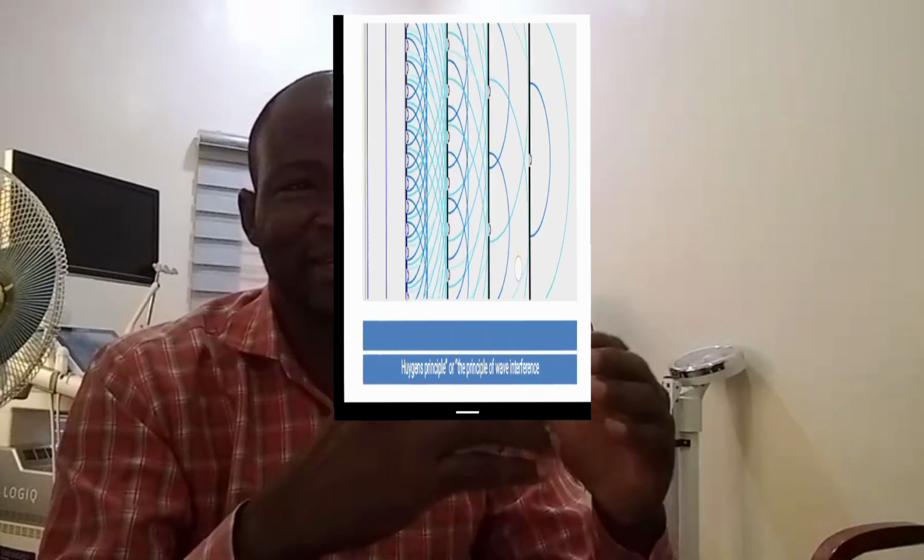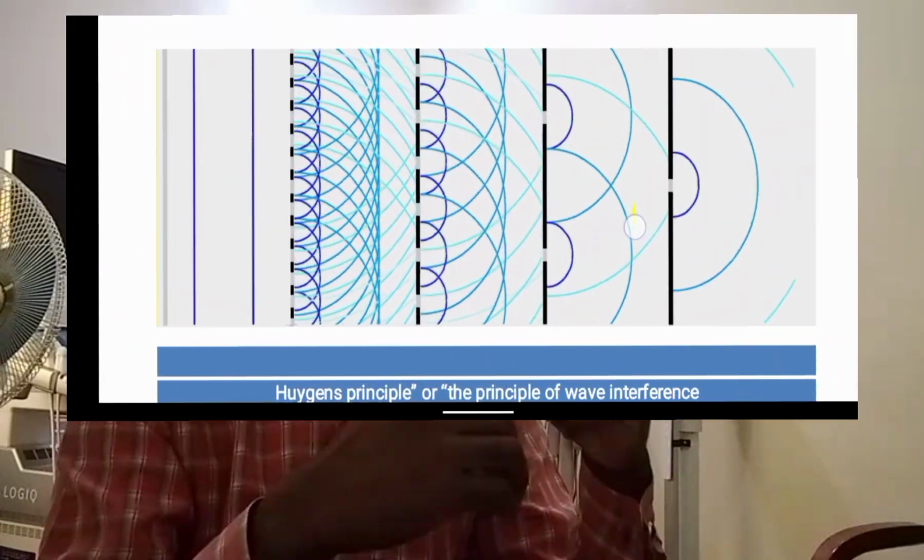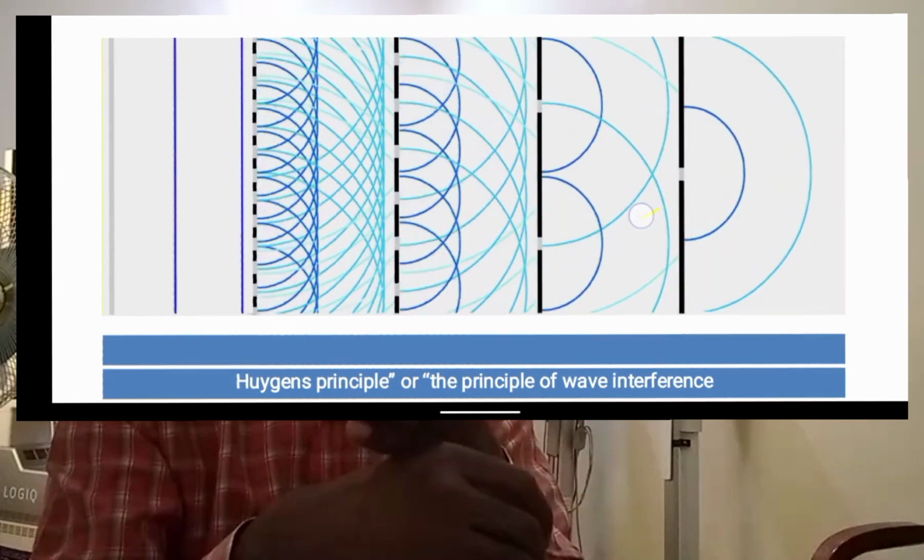This image gives you an idea of sound passing through various apertures at multiple checkpoints. Diffraction is the breaking up and spreading of a beam from a small aperture. So beam profile also depends on the diffraction pattern of ultrasound transducers.